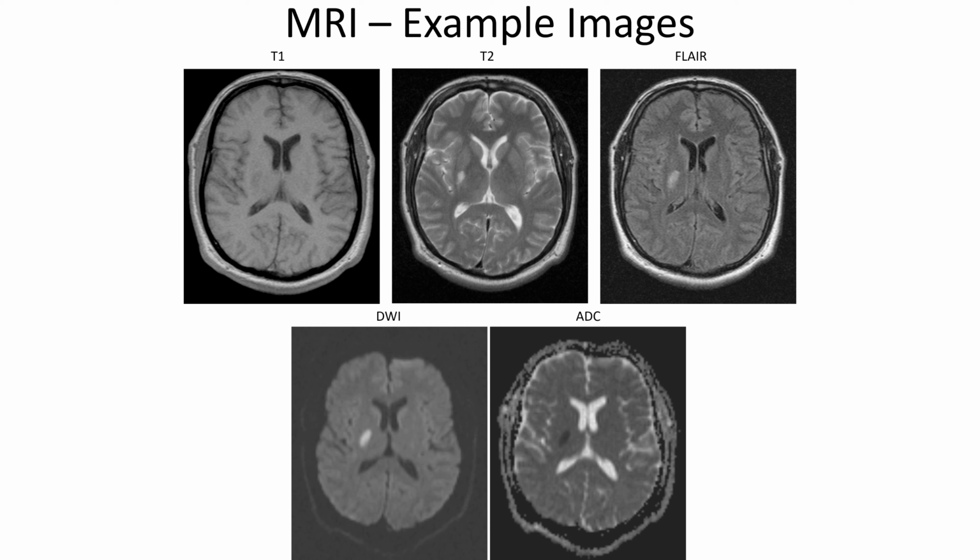And that's why that white spot appears in the internal capsule on the patient's right in the DWI image. That's showing a small infarct in the tissue. Likewise, the ADC is kind of like an inversion of the DWI image. Not quite, though. I'll explain why later. But the ADC stands for apparent diffusion coefficient. And here, that is showing up as a dark spot on the internal capsule, showing a small stroke.